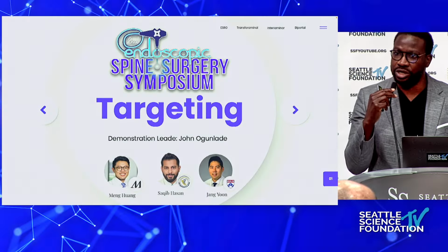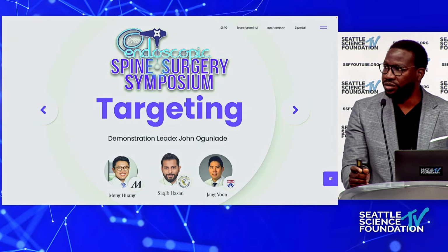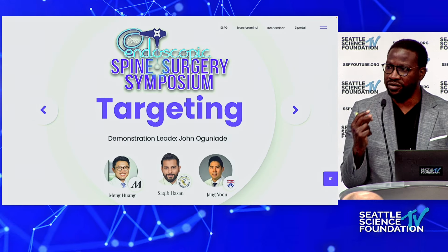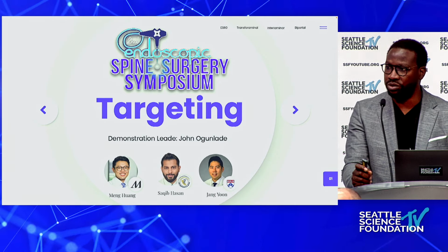Yeah, we're gonna start with targeting, and pretty much this is probably the most important part of the case, right? If you have bad targeting, if you start at a bad location, it's just going to make the case that much more difficult for you.